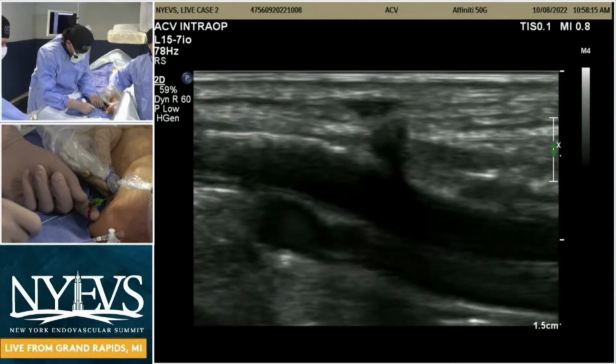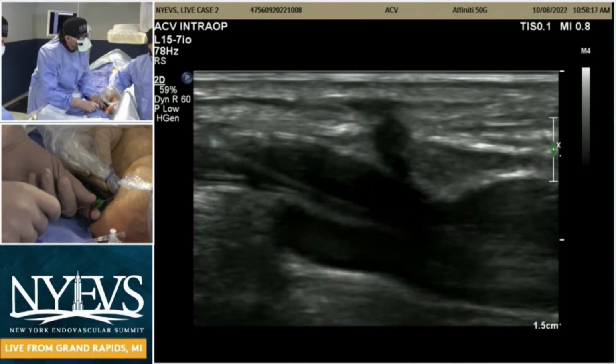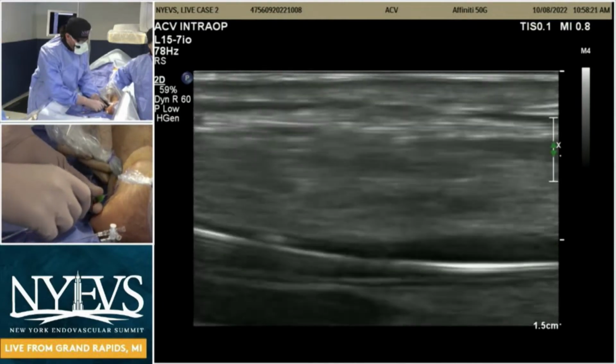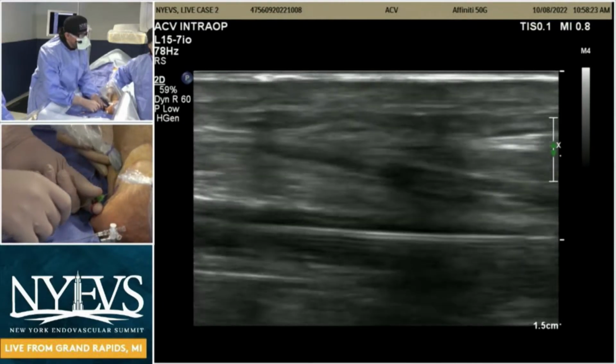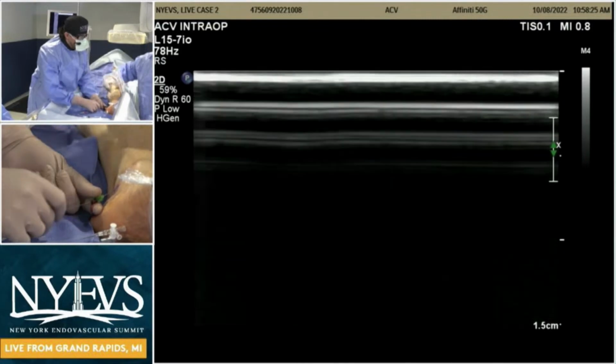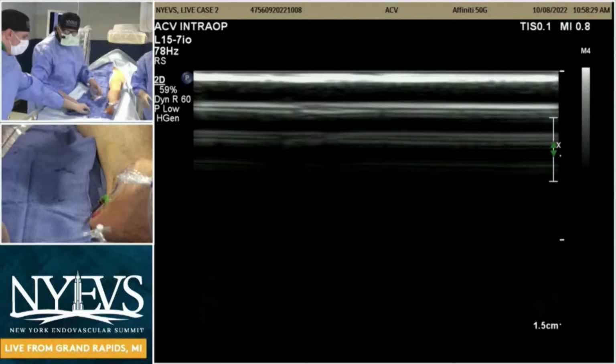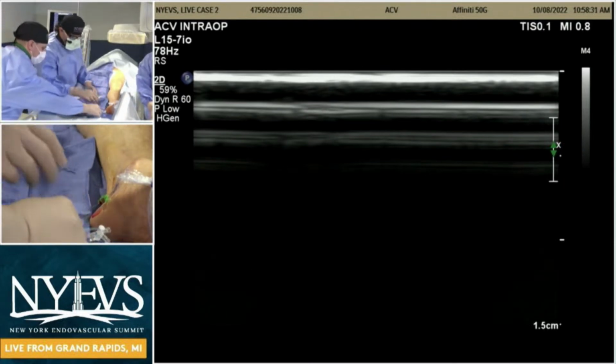I generally don't primarily do pedal-only approaches for things, so I would start probably contralateral groin up and over, do my angiography, get down, do my intervention, but just like Fadi's done here, I'd have the leg prepped out and be prepared and ready to go retrograde tibial access. Let's have a Navic cross, guys. Engel, oh, we have it. Any thoughts from anybody else?